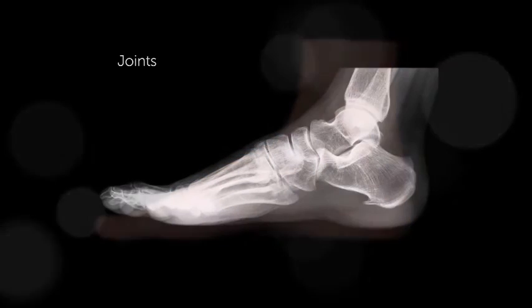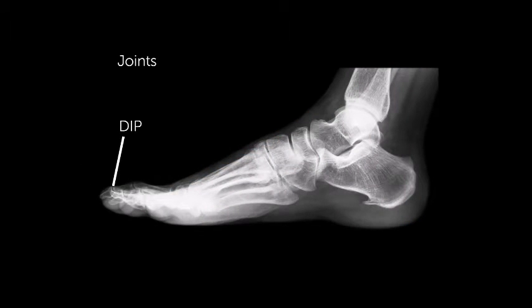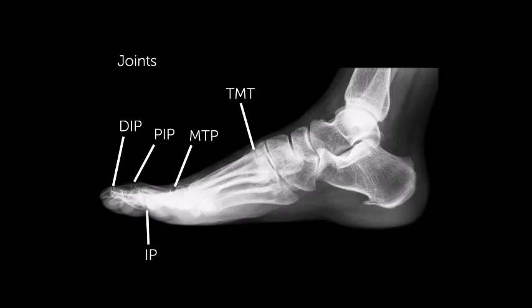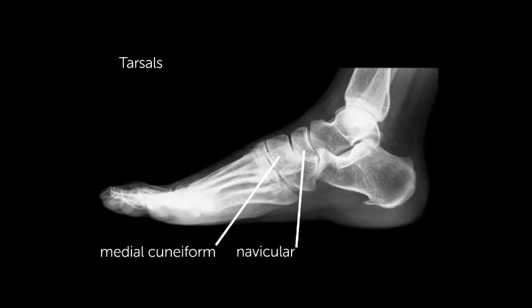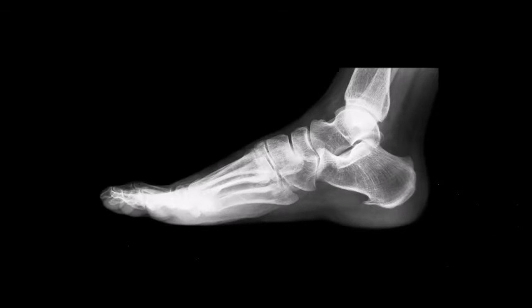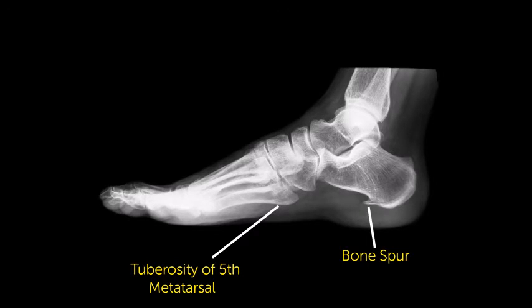In this lateral view of the foot, we are able to have some assessment of the joints of the phalanges; however, they are superimposed on top of one another. We do have good visualization of the tarsal-metatarsal joint spaces and good views of all of the tarsals. The tarsals are seen in profile, including the medial cuneiform, the navicular, and the talus and calcaneus — two of which were not well visualized on the AP x-ray. On the lateral film, we are also able to see the metatarsal in profile and this interesting bone spur on the calcaneus.